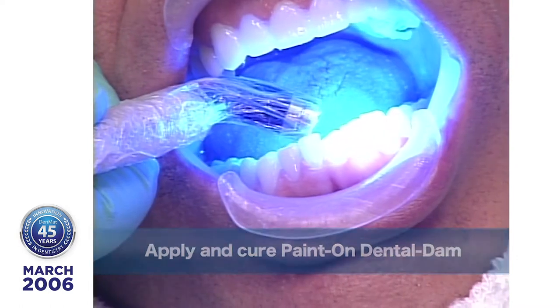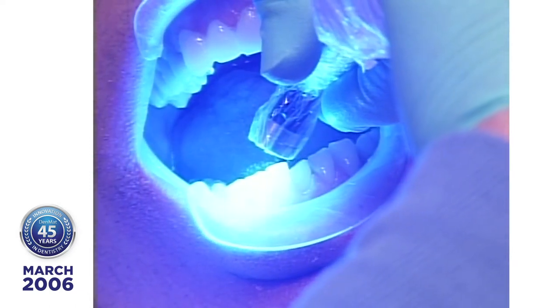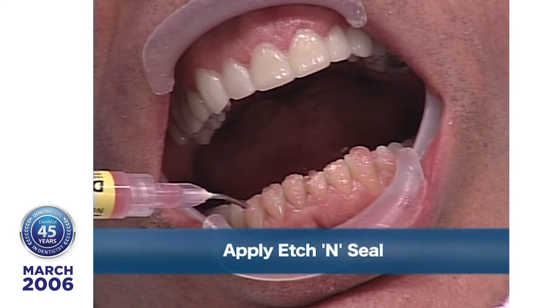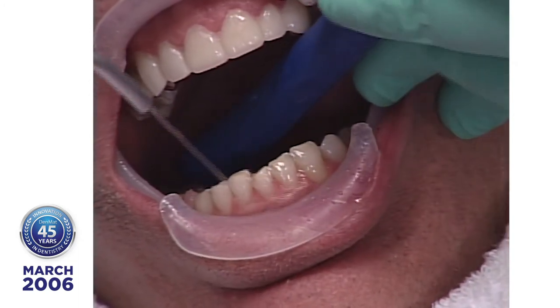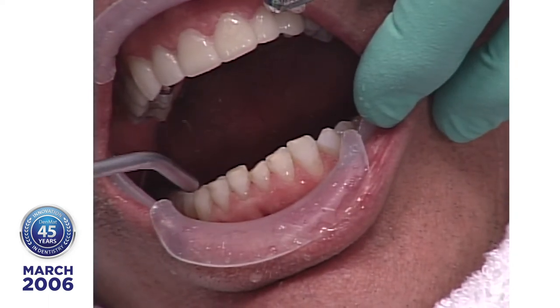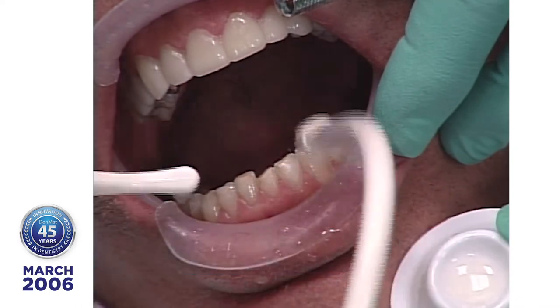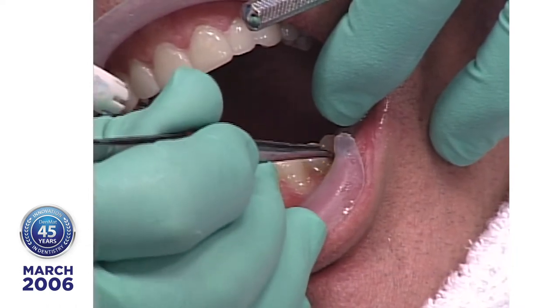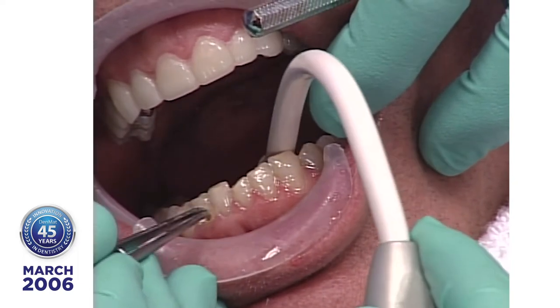Close your eyes. Okay, now you got to put your tongue back there. And now we put Tenure S on. We already have picked out the shades, so we know about that. See, a race begins between contamination and resin. And whoever gets there first, or whichever gets there first, wins.